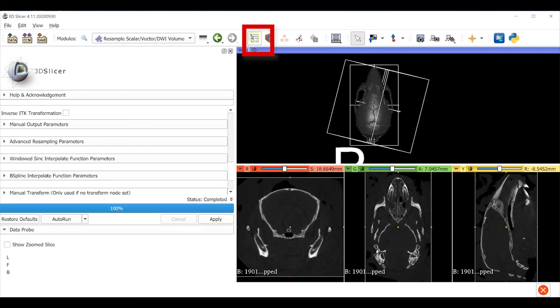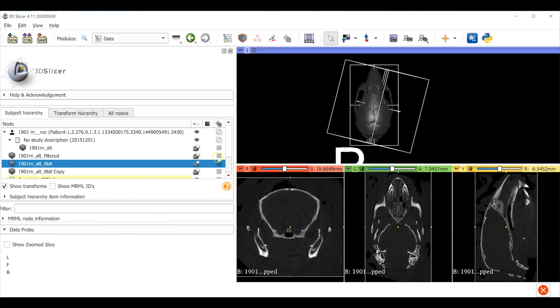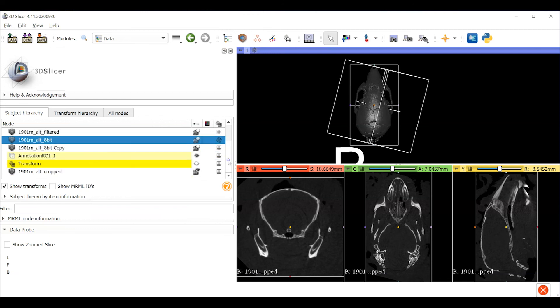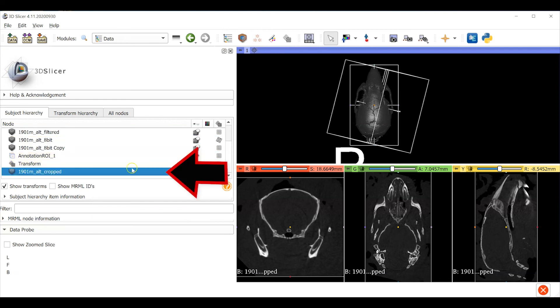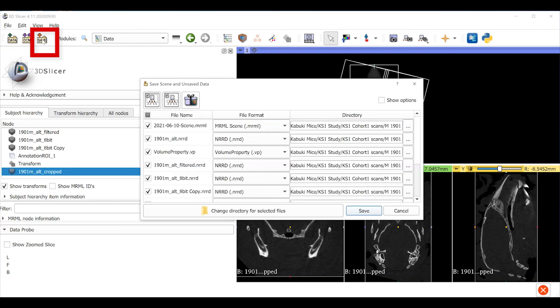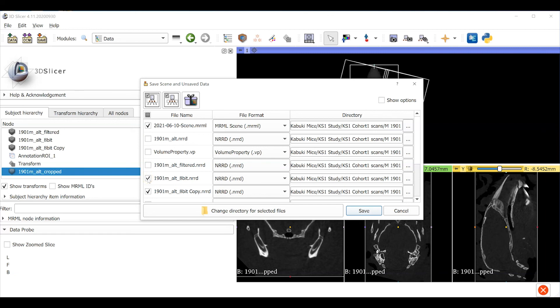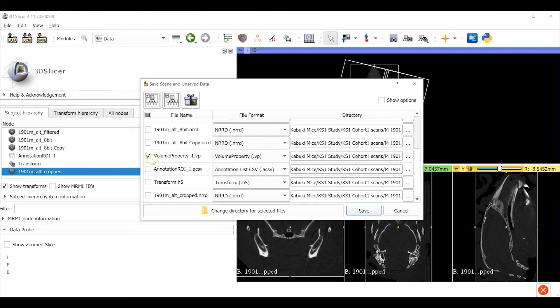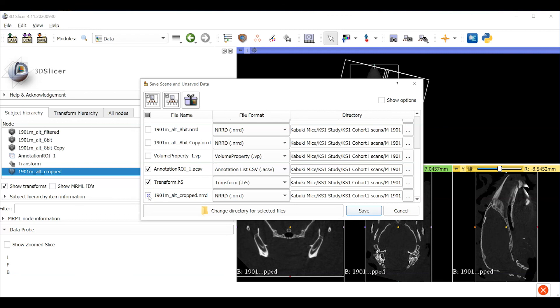Back in the data module window you can see that the new volume has been created. Be sure to save your data. You can use the save data icon which will open a window and give you the option to save all of the data objects. We don't really need to save everything and each image volume can take up a whole lot of disk space. As long as we use good lab practice and we keep track of our workflow in our lab notebooks we can recreate most of these objects. The important objects to save are the ones where you used your discretion. So we saved the transform because you decide how to rotate the object and we saved the annotation because you decide where to put the limits on this particular object. And of course our goal was to create the final transformed and cropped volume so we're going to save that.